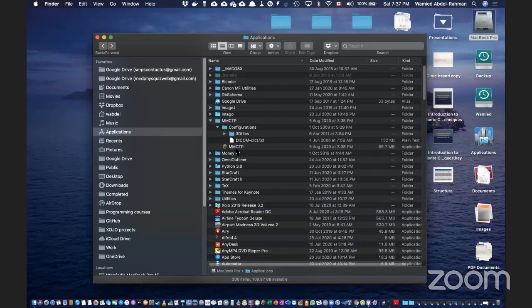The version, Andrew, I sent him a few messages, and I'm trying to point out. I'm trying to help him to update it because I've managed to fix that problem. But I think for older versions of Mac, there is no problem.